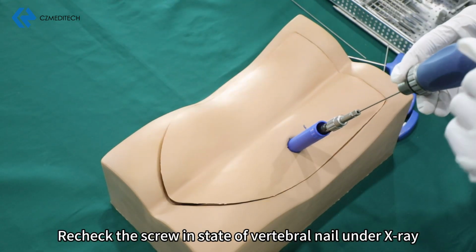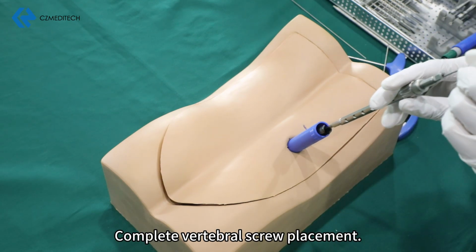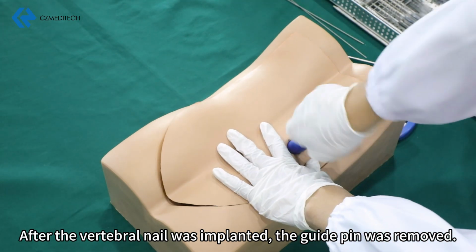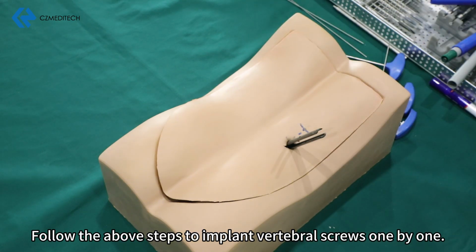Recheck the screw-in state of the vertebral nail under X-ray. Complete vertebral screw placement. After the vertebral nail was implanted, the guide pin was removed. Follow the above steps to implant vertebral screws one by one.